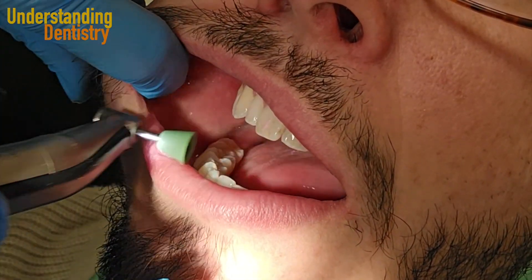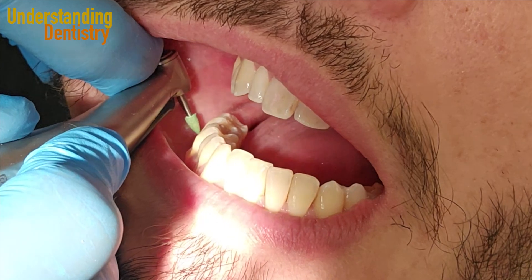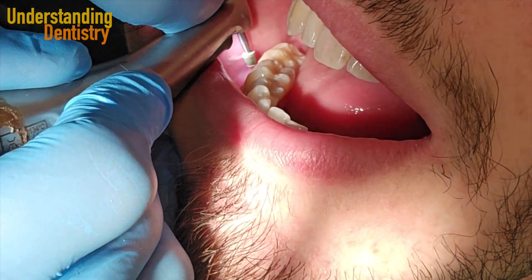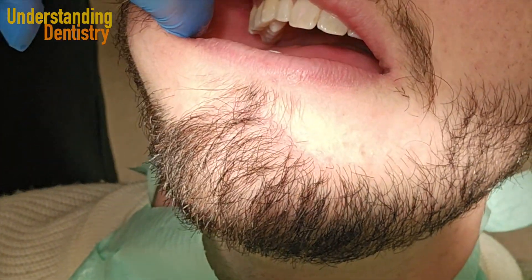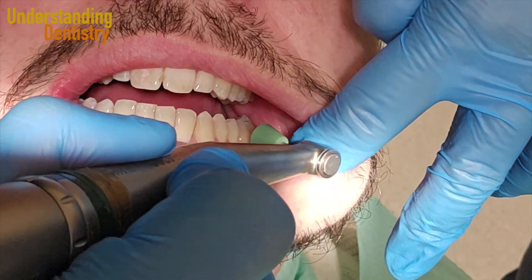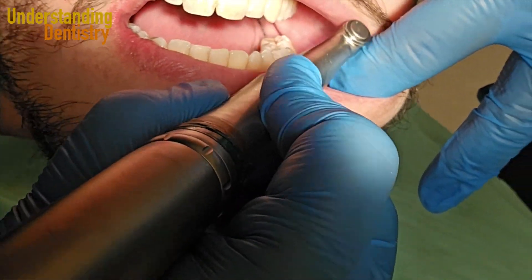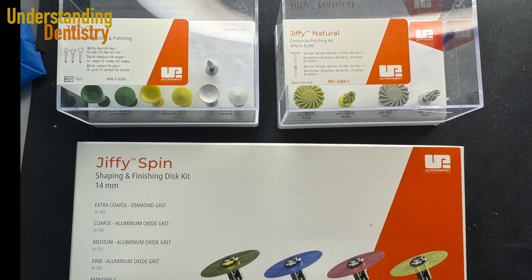Now let's see how to handle Class 5 restorations. It's a little bit tough to fit the tips close to the cheeks, but you'll find a way, especially working with a dental assistant, to polish Class 5 restorations that are very close to the gingival margins. First use the cup shape, and then the flame tip.